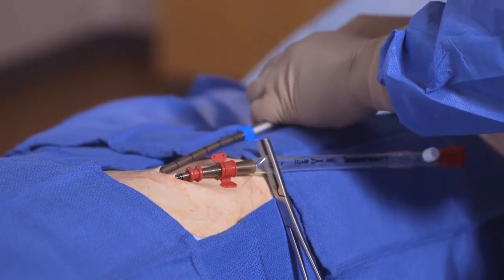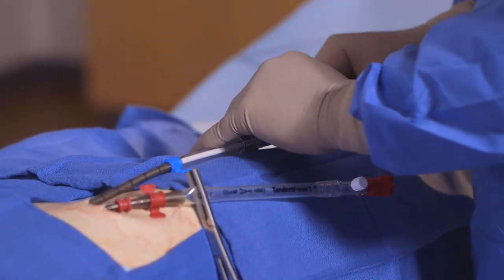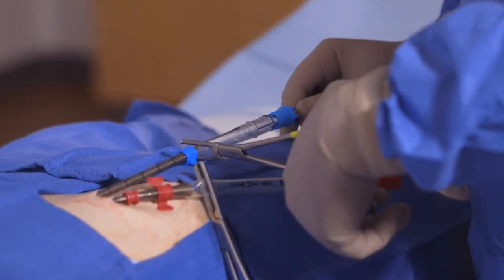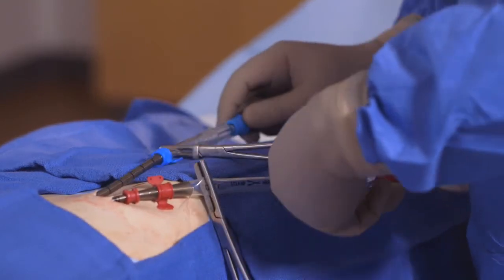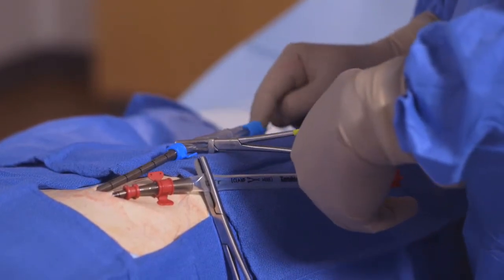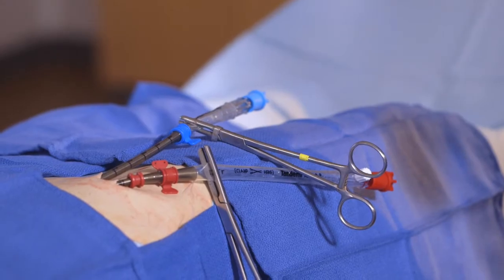Confirm that adequate volume exists in the left atrium via pressure transducer. Next, remove the guide wire and introducer until they are beyond the clamp area of the cannula. Then, leaving the hemostasis valve in place temporarily to control blood loss, clamp the cannula in the clamp area and remove the obturator, wire, and hemostasis valve from the cannula.